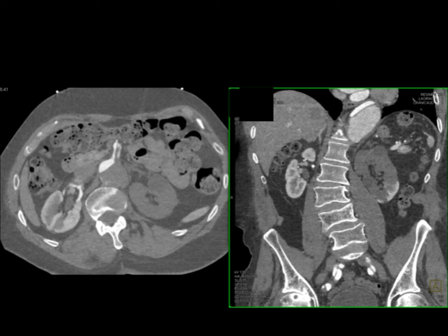And then what happens is if you have vessels, like in this case the renal arteries supplied from the false lumen, you don't see flow in the kidney. The reason you see flow in the lower pole is the patient invariably has a small branch to the left kidney from the true lumen, which explains why there is some flow in the lower pole of the left kidney. If you go back 30 seconds later, you will see good visualization.